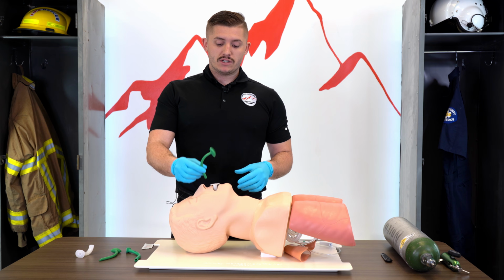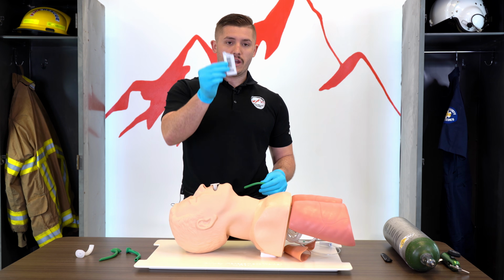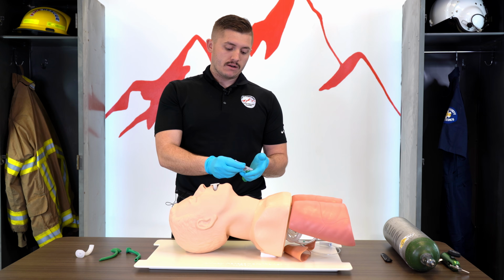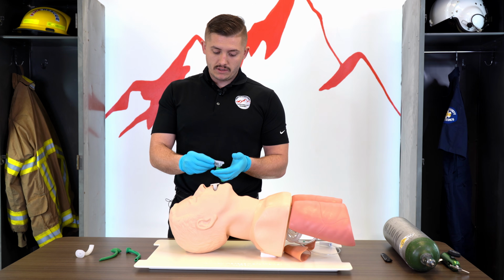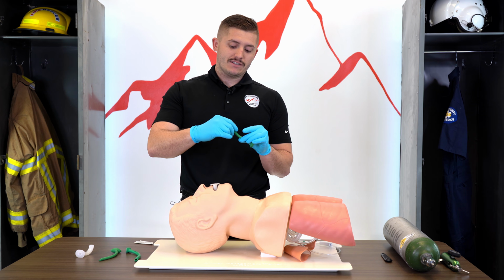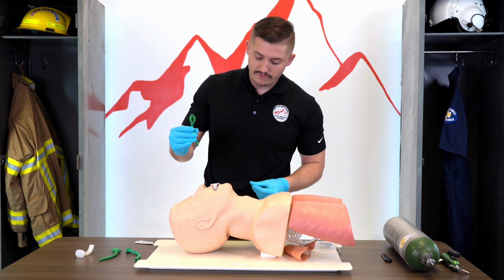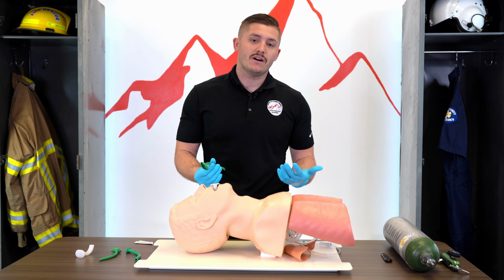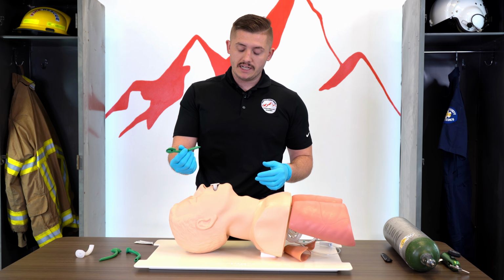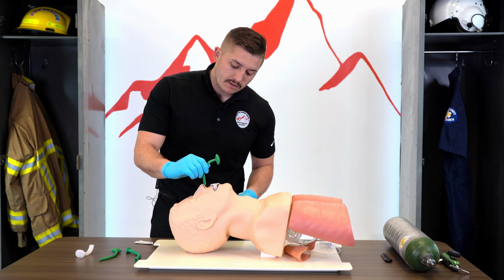Before I place this in my patient's nose, it has to be lubricated. Most departments or agencies will carry little packets just like this full of lubricant. Typically, I'm just going to take it, place it on my NPA. Don't need a lot. Our nose has so much vasculature, so many little capillaries that are very easy to damage, and we can actually cause a lot of bleeding. So if we're sticking this rubber in there, it's going to cause a lot of bleeding and a lot of harm. So if you can lubricate it, you're going to do your patient a favor. So that bevel towards the septum.